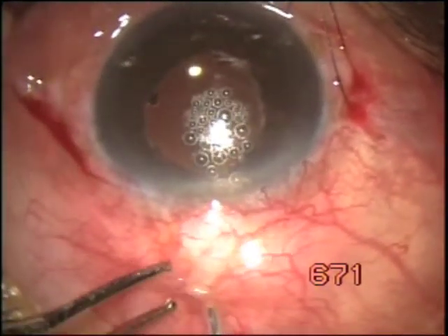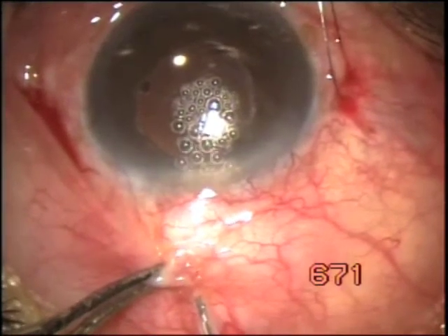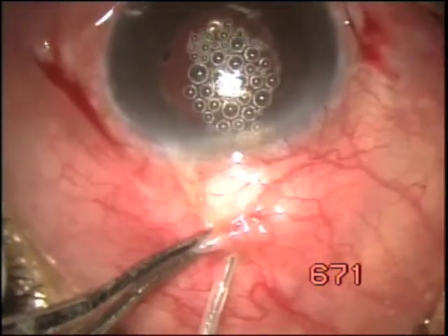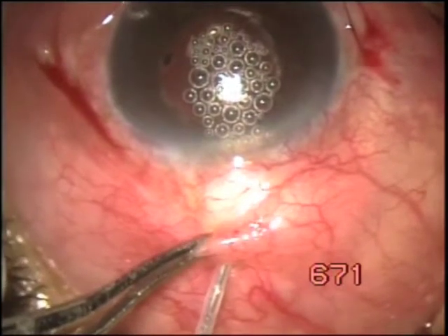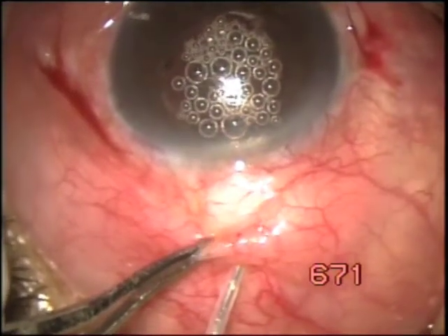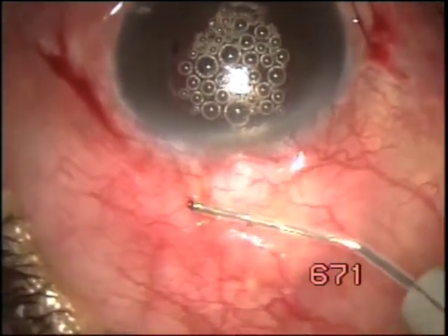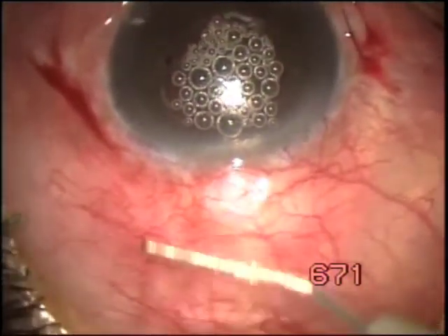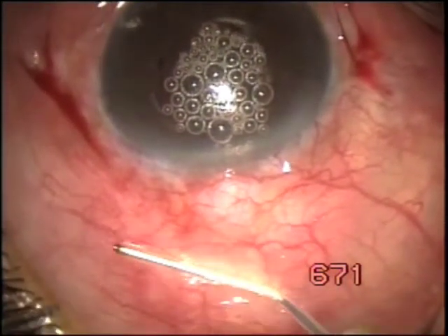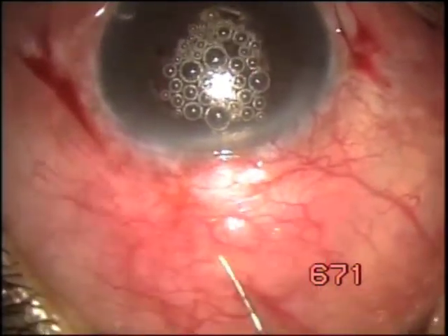The wall disappears in an area of about 0.4 millimeter. Touch it at a number of points and destroy the wall from one end to the other. The cavitation bubbles enter the anterior chamber, proving the connection between the Tenon's cyst and the inside.